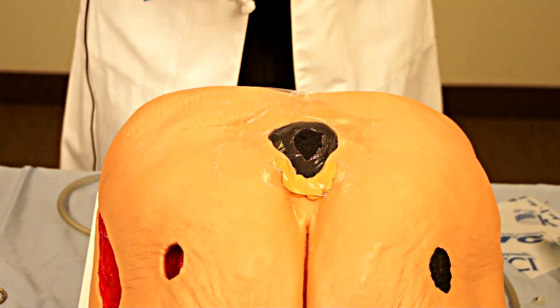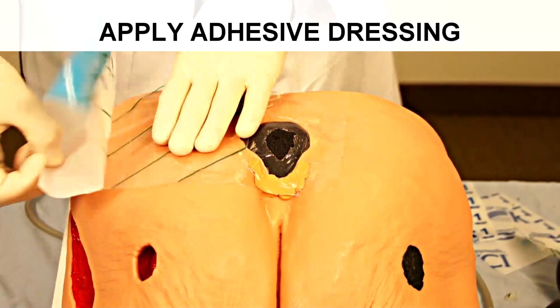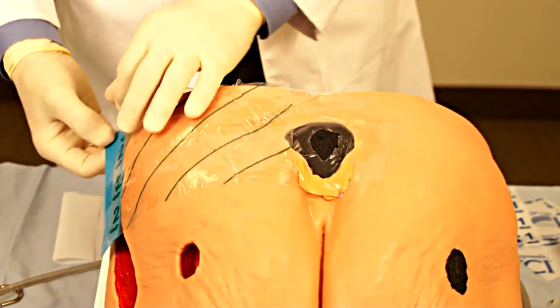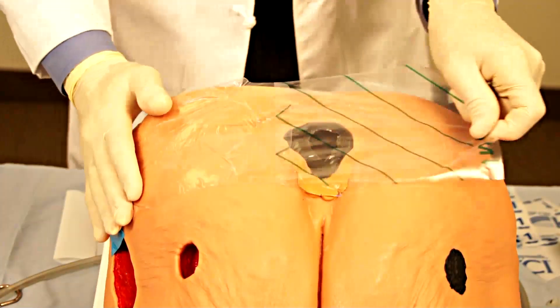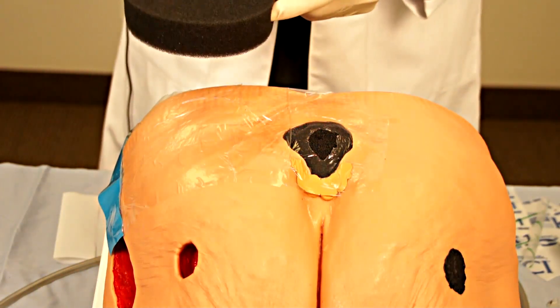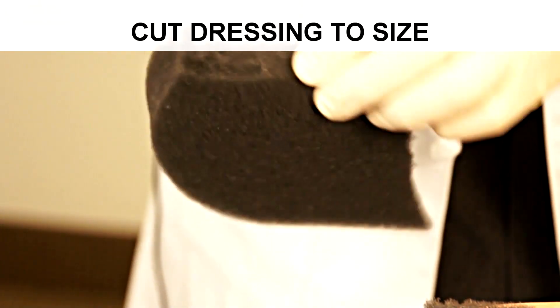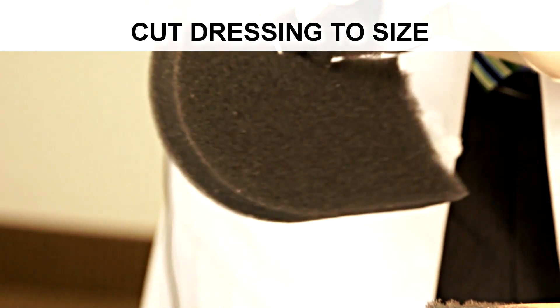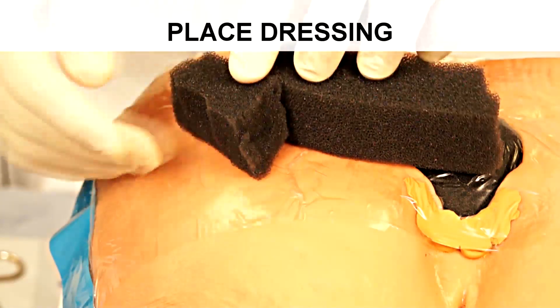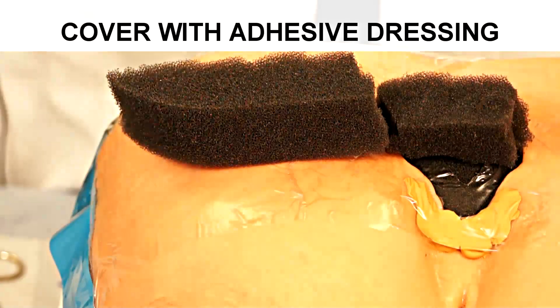What you would want to do first is to lay down a layer of the adhesive dressing from the wound, extending to where you would like the negative pressure tubing to be located — in this case, off to the side. Once this has been laid down and the backing removed, the next step is to cut a strip of your foam dressing approximately the length of the distance between your wound and where you would like your pressure tubing to be located. Then position that foam strip and cover it with another layer of adhesive.